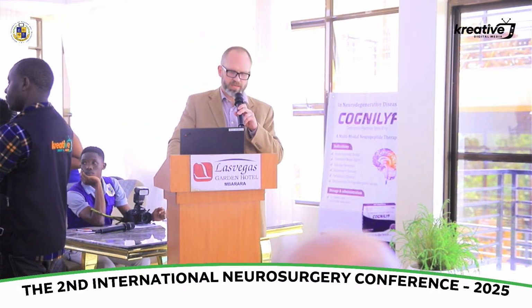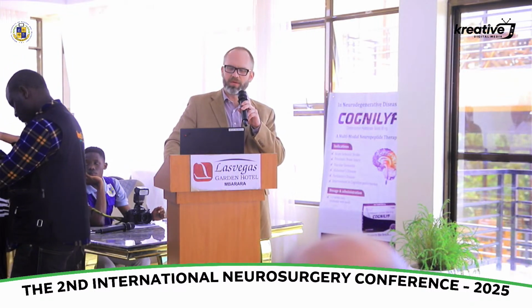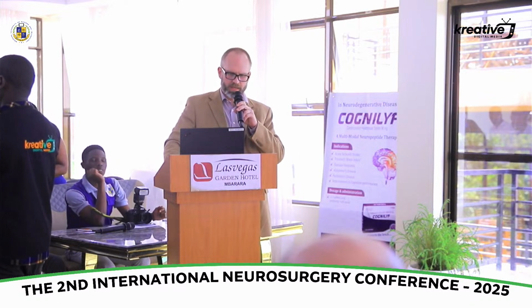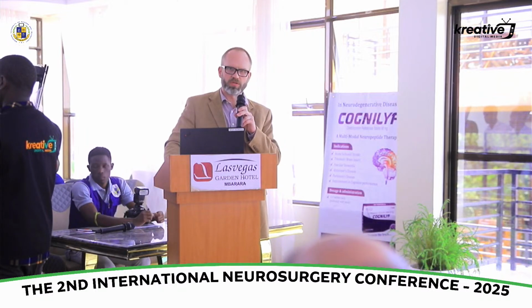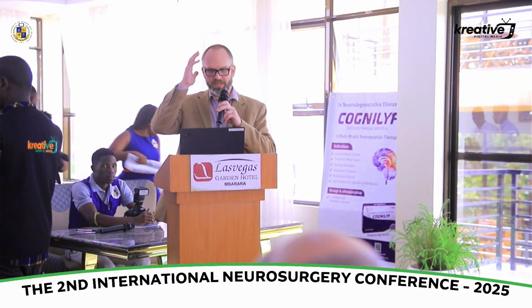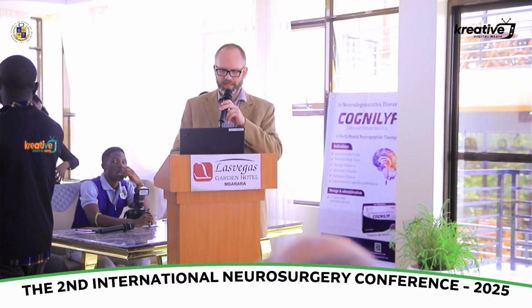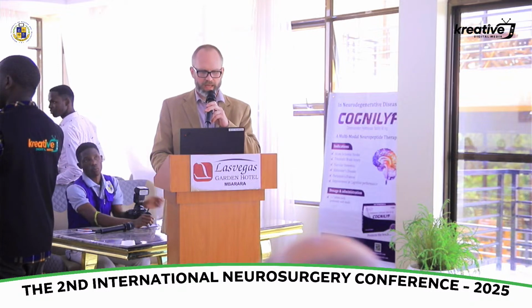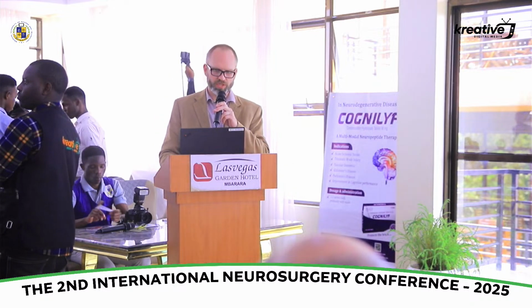First use of B-mode ultrasound where you could actually see an image was in 1978. It was for a spinal cord tumor. And brain and spinal cord parenchyma have viscoelastic features that permit exceptional ultrasound propagation. When you're open at surgery, you avoid attenuation of the ultrasound beam by skin or connective tissue or bone. And it's real-time information, so you get a superb temporal and spatial resolution.